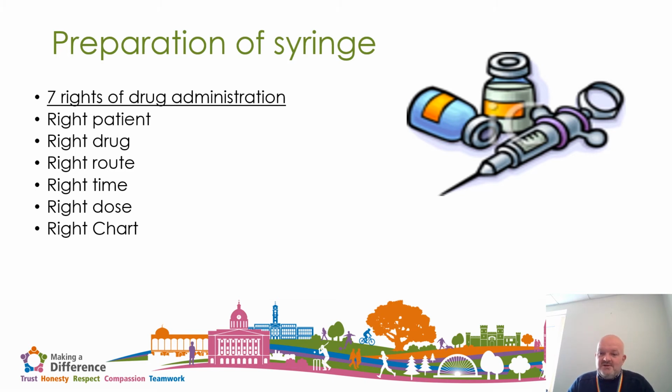prescription, so that you know that if you pick up the red chart to change the red syringe driver, but the syringe driver you've got has got a blue mark on it, you've got the wrong syringe driver and you need to switch it for the red syringe driver. It's just a very easy way of recognizing the 2 drivers.